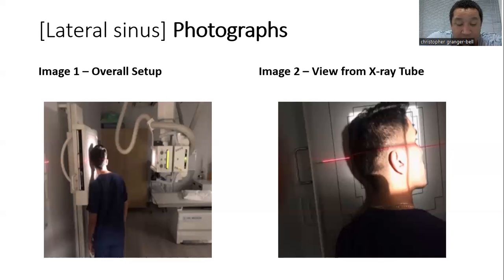CR location was 40 inches from the patient to the point midway between the outer canthus and EAM. There was no angulation of the tube for this exam. I collimated the beam to the four sides of the anatomy in question. The visual appropriate marker was on the upper right side of the IR.